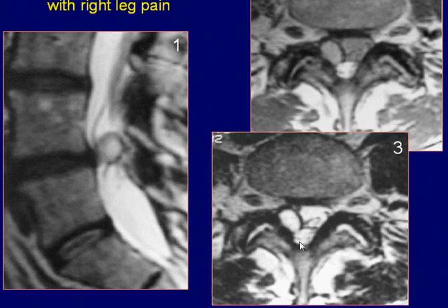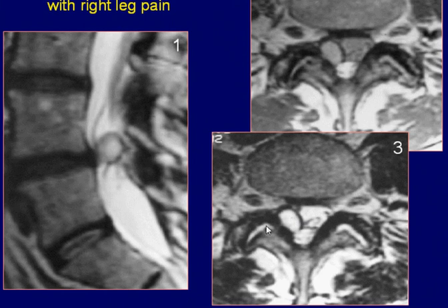Axial proton density and T2-weighted images show the lesion located at the right posterolateral aspect of the spinal canal with close anatomical relationship to the degenerated right facet joint. The lesion is similar in signal intensity to the synovial joint fluid and has a distinct hypo-intense capsule.